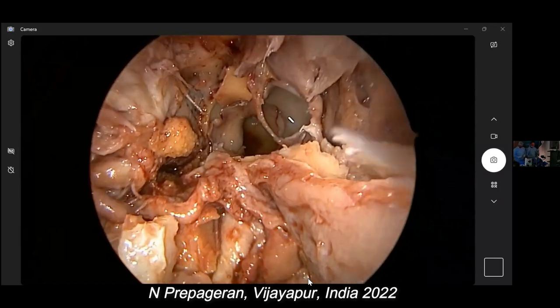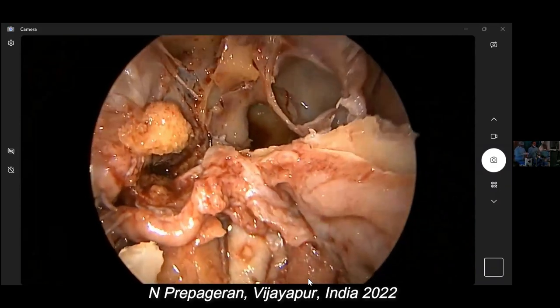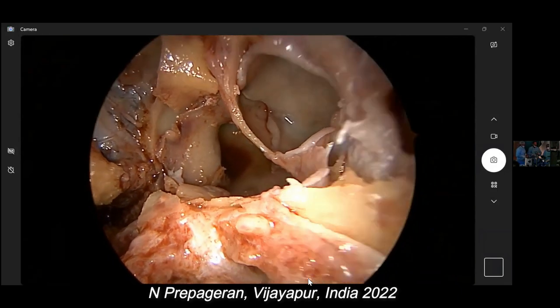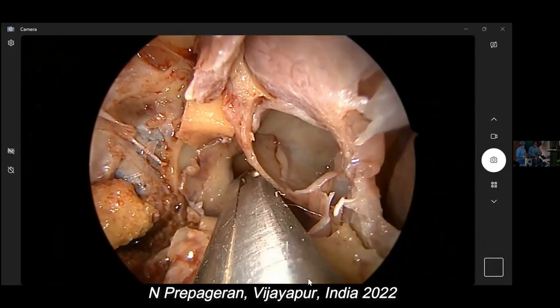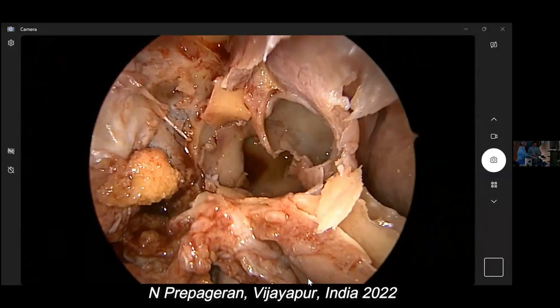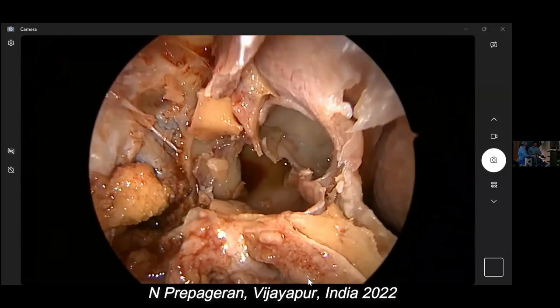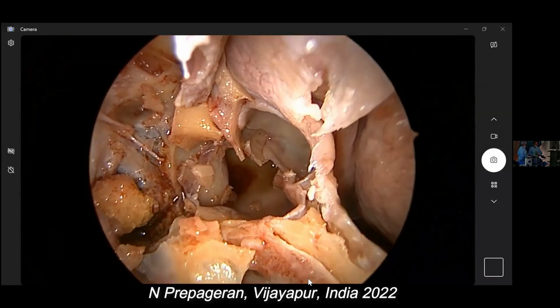Crescent punch? So now let's open. It's a large air cell occluding the sphenoid sinus. So now I'm going to open the large air cell so that you can see the sphenoid sinus. Okay? Yes, sir.